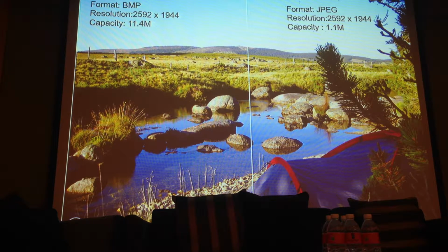So it's 1/10 of the size of the BMP. JPEG is a compression algorithm that reduces the size, but still keeps very good image quality.